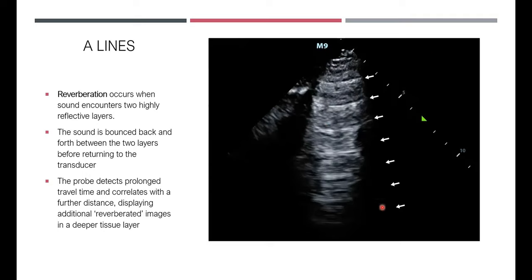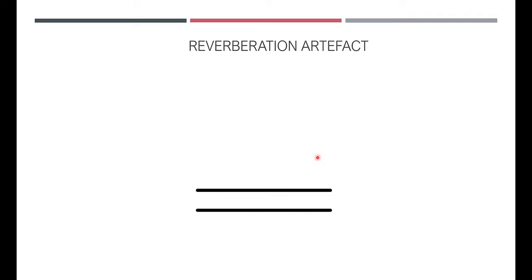Depending on attenuation, and you can see that actually there's not too much attenuation in this particular lung field. I suspect the reason for that is, this is 9, so the frequency is on the lower side. Because there's less attenuation, you can actually see the deeper areas of the lung really nicely. But from my perspective, what you're classically seeing here is pleura with classical A-line appearance. This is normal. These are because of horizontal reverberation.